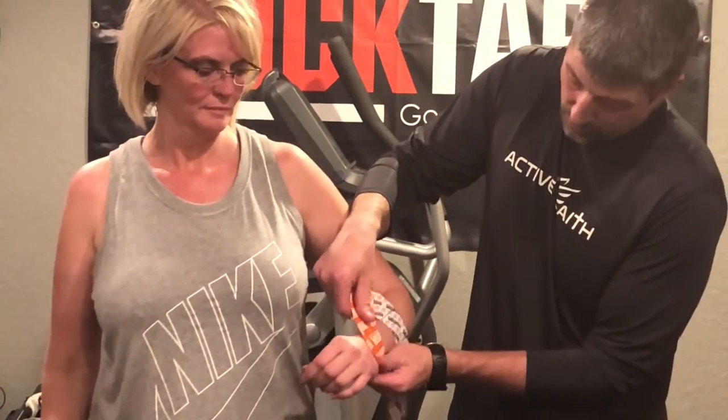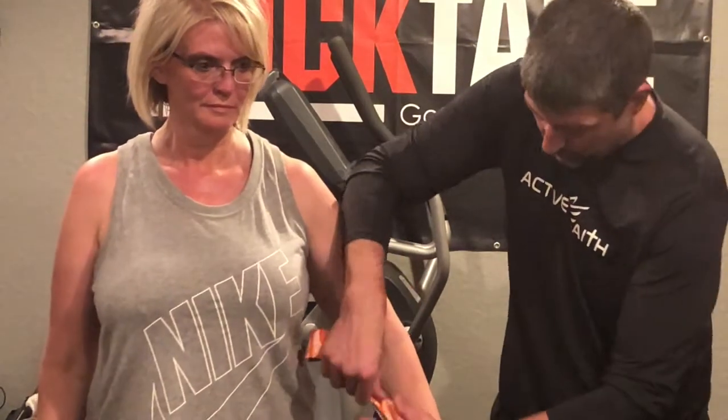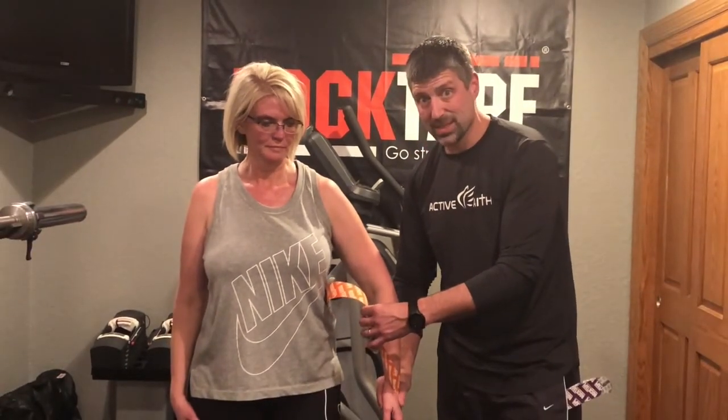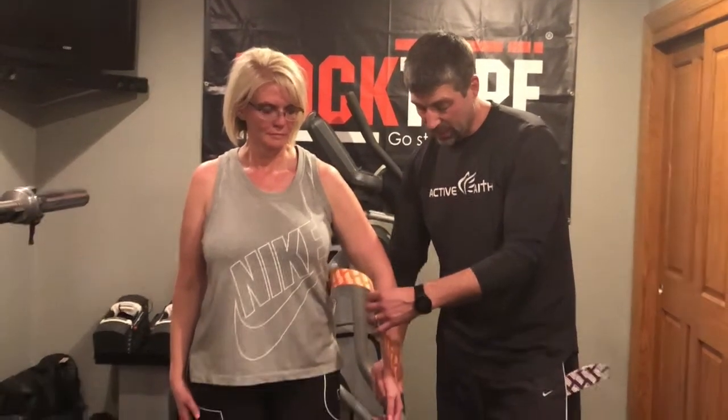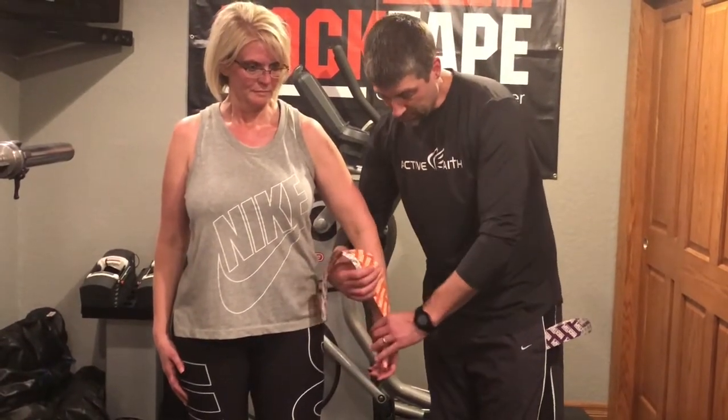We need to make sure we pick a really good angle. I can either go neutral, or if I really want to bias this to control the pronation and supination, I can bias her out just a little bit into supination and she's going to hold that there.